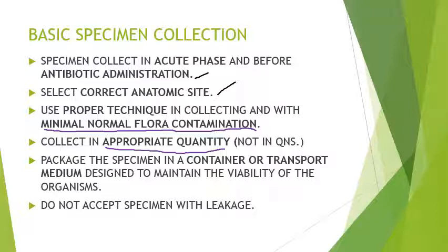Another consideration that we need to follow is the packaging of the specimen. Note, the container or transport medium must maintain the viability of the organism. The container must not be tampered with, nor have a leak. Another is proper labeling. The label must be in a complete form, no abbreviation.